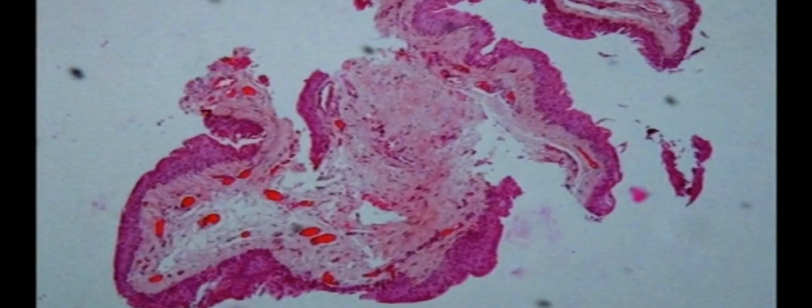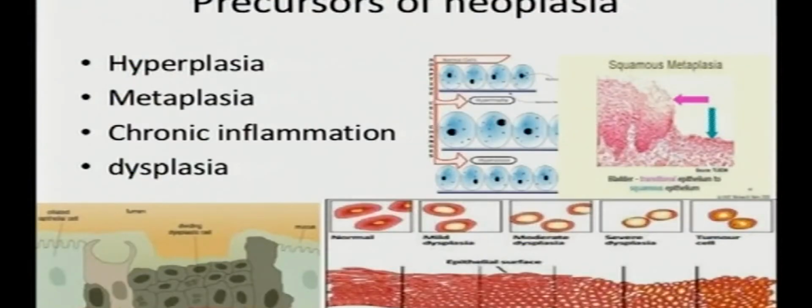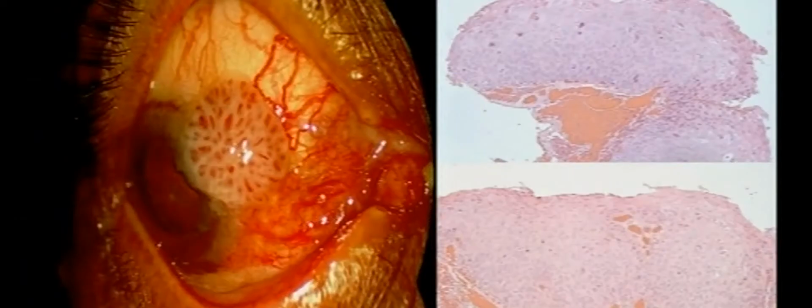As you know, in pterygium you have to see this dysplastic area, much more dysplastic. Whatever we have seen pathologically, the dysplasias can be mild, moderate, or severe, depending on the involvement. If it breaches the basement membrane, then it's an invasive squamous cell carcinoma. Again, this is either a papilloma or a tumor.